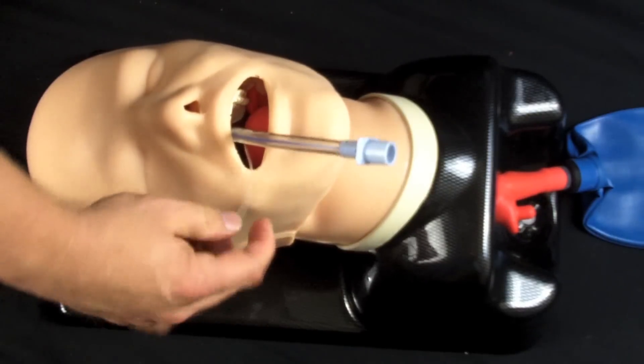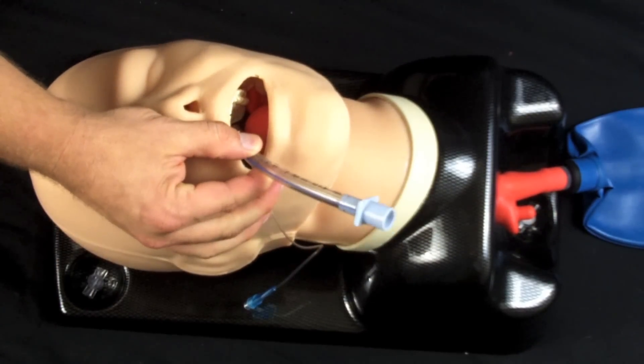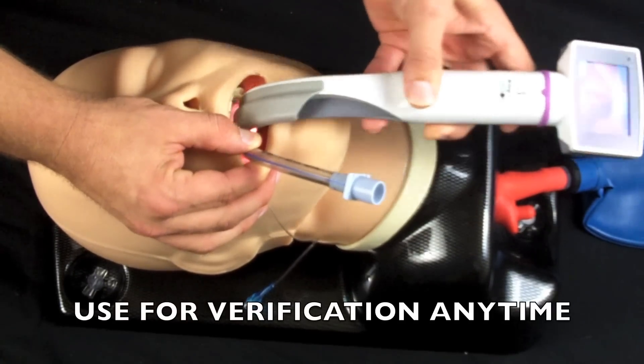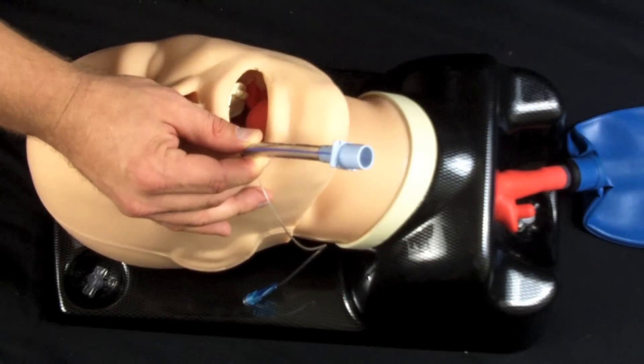Now you obviously need to go ahead and inflate your cuff at this time and listen to your lung sounds. But if you wanted to check real quickly to make sure you were still in, you can always re-insert the blade, come around the corner, take a quick peek again, and see that you're right in the right location still.